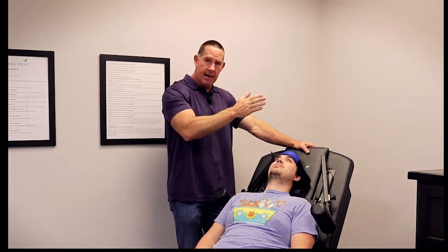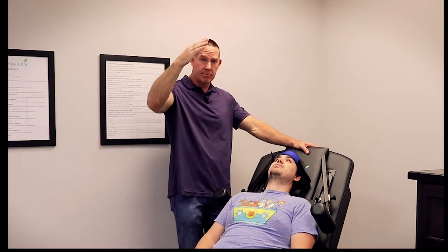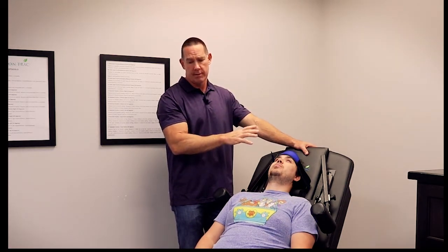The programs I like to run are A, B, or C. A is static traction — just a straight static pull and hold. B is gradient traction: it takes three steps to get to your full pull, so if you have a three-inch pull, it goes one inch back off a half inch, two inches back off a half inch, then three inches — three pulls to reach the full. C is intermittent: it goes straight to three inches and then backs off. I like to hold people between about two to two and a half inches when we initially start, and I may work up to about three inches. It should be a gentle pull — not heavy on the neck.